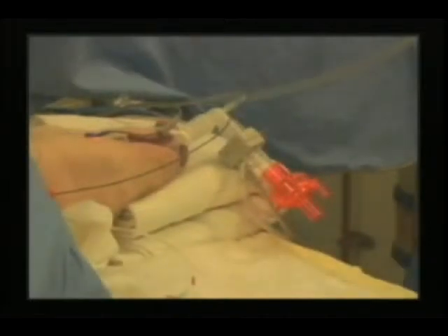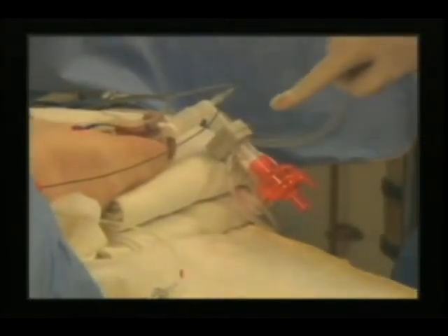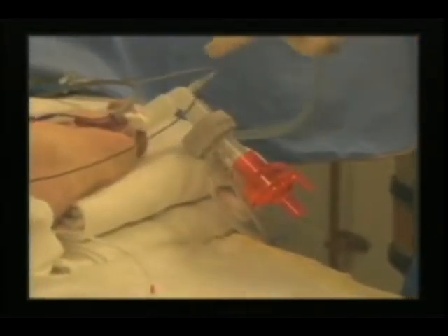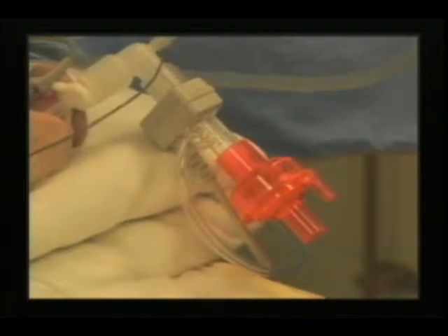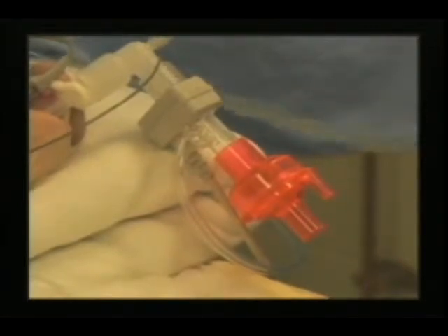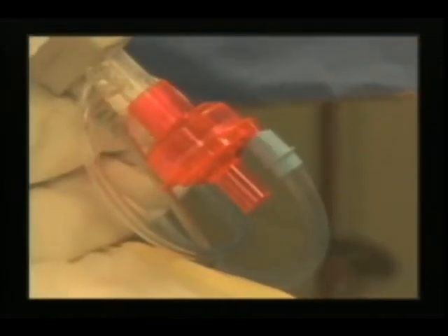With this setup, the ResQGuard is attached to an end-tidal CO2 detector for the Cosmos monitor, which is attached at a right angle to the endotracheal tube. Oxygen can easily be applied by connecting the oxygen tubing to the ResQGuard oxygen port as shown.